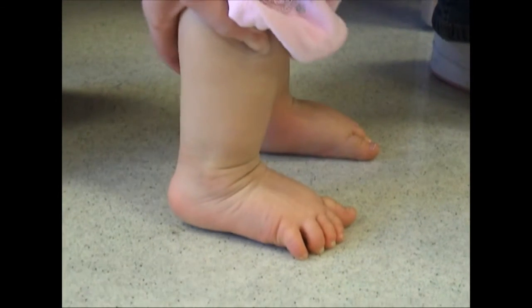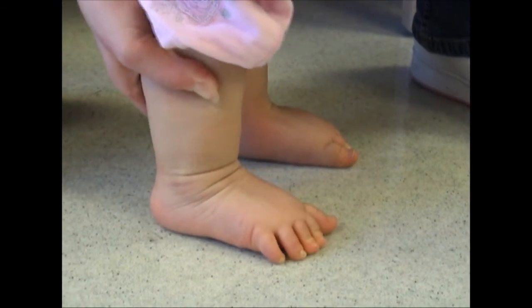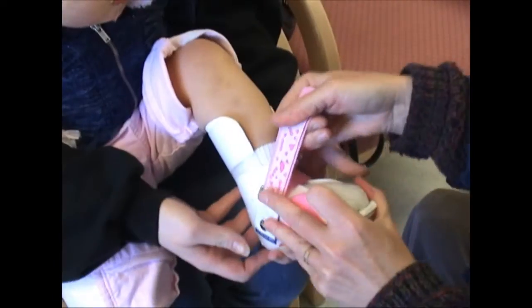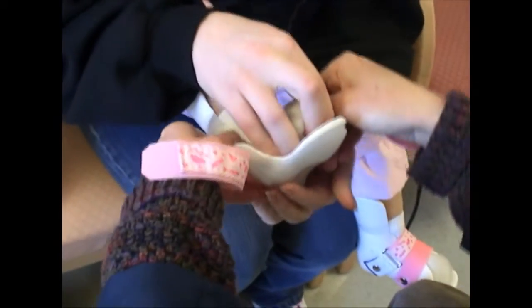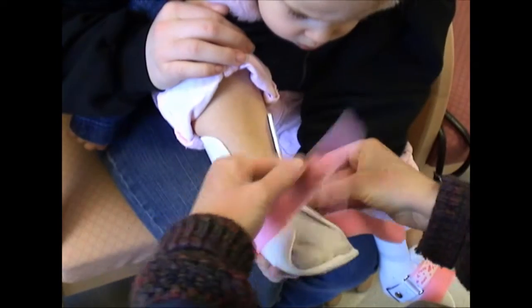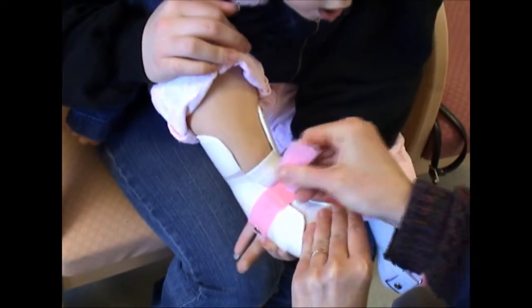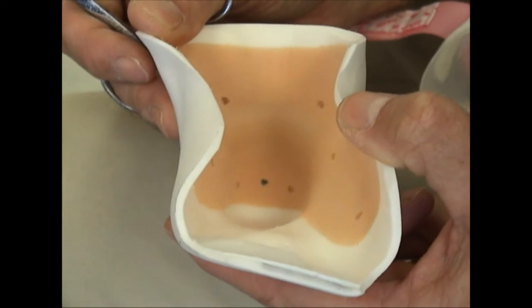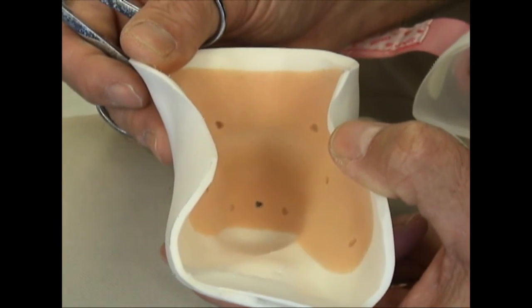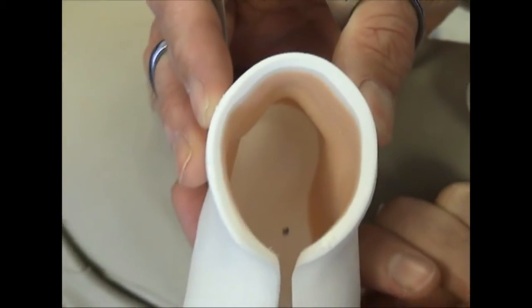When she does that, however, her feet are in a moderate amount of pronation. We had tried some different braces in the past with Summer and had concluded that going with a Softee DAFO 3 would be the best solution for her in controlling her strong plantar flexion. With this type of device, we were able to incorporate a heel control pad to keep the heel seated and prevent the excessive plantar flexion.